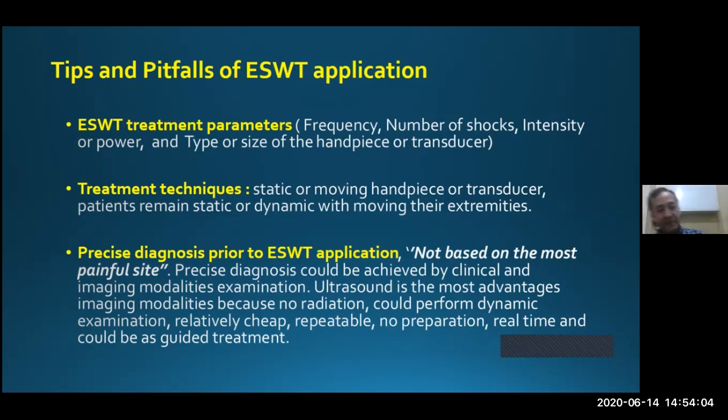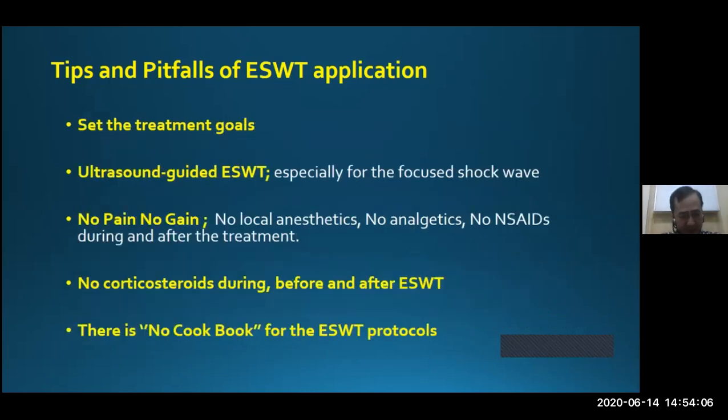And then what are the tips here? Set the treatment goal. What is the treatment goal of the shockwave? Is it just for pain relief, or is it for regenerative effects or others? And then, ultrasound-guided shockwave. It is better when you are familiar with musculoskeletal ultrasound. You can use musculoskeletal ultrasound to perform the shockwave as guidance.